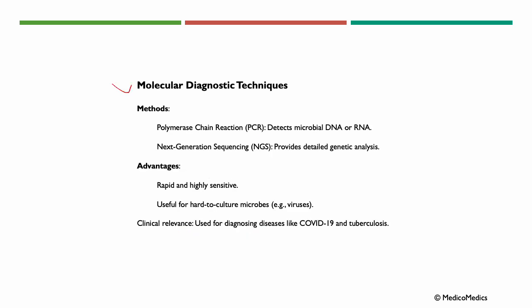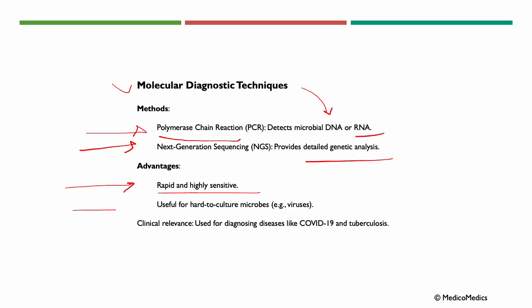Molecular diagnostic techniques. Methods include polymerase chain reaction, which helps us detect microbial DNA or RNA. We have next generation sequencing, which provides detailed genetic analysis. The advantages here are that they are rapid and highly sensitive, and useful for hard to culture microbes like viruses.